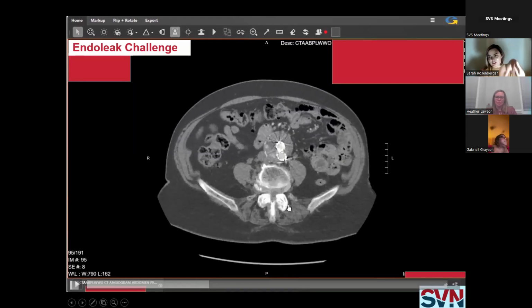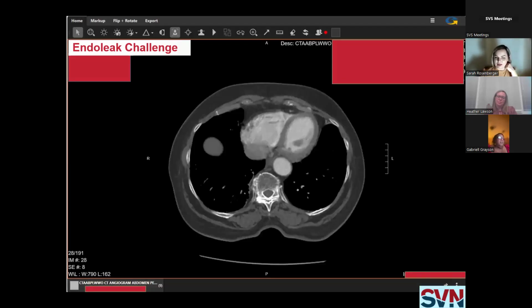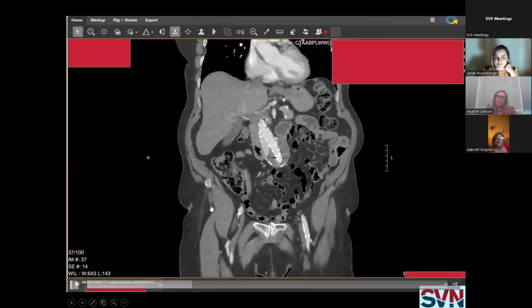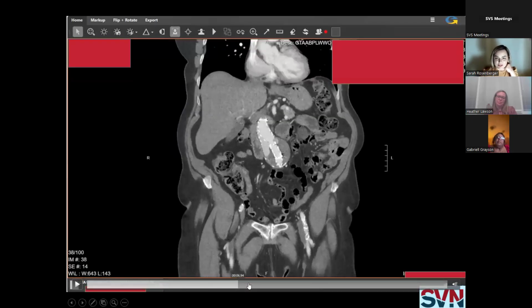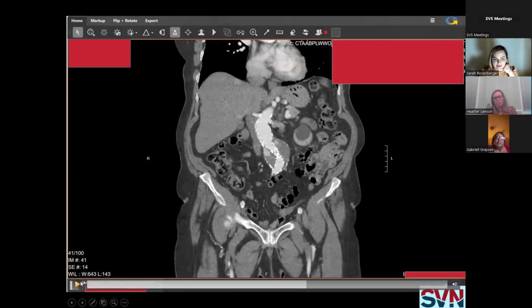So as long as there's arterial pressure coming into the sac, it's looking for ways out, right? And so that might trick you into thinking it's a type 2, particularly if you don't notice the poor approximation at the top. I wanted to share this part here because you might, if you were looking at this, say, well, the struts of the stent are way up here and the contrast is right along there where it's a problem. But if you'll recall, I'm going to stop sharing now.